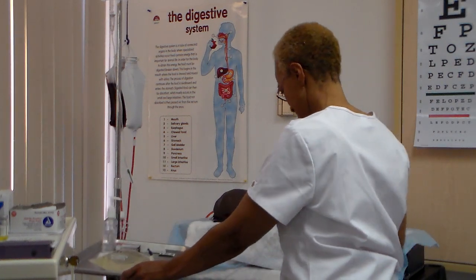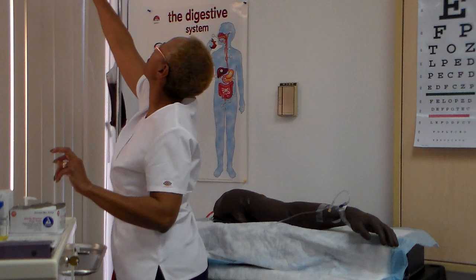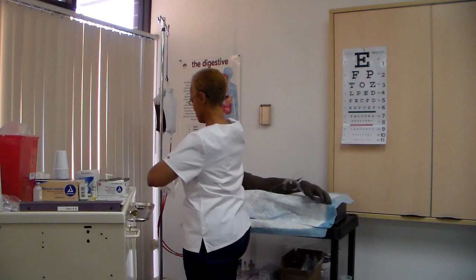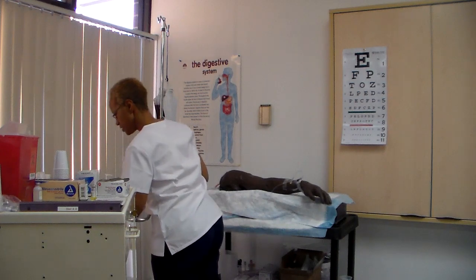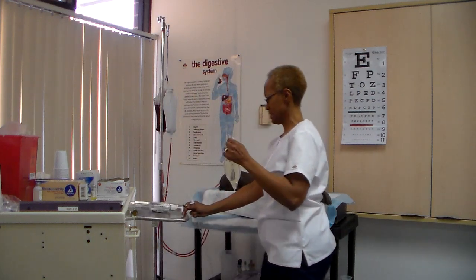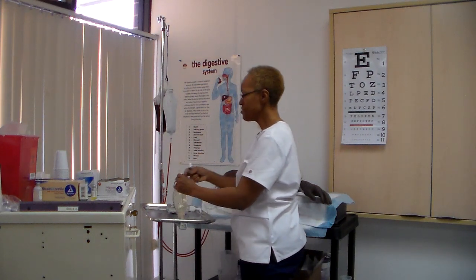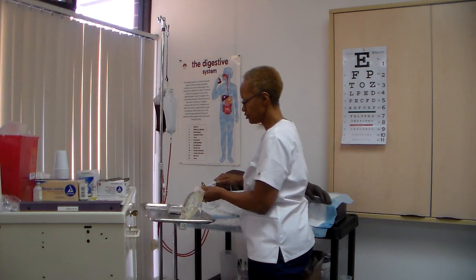Connect new infusion tubing or spike container with existing tubing. Regulate infusion at ordered rate. Okay, so I'm gonna take this bag. Making sure that you maintain asepsis, don't contaminate. Okay, see? Make sure you don't contaminate where you're going to, don't touch your spike and don't touch your insertion port.